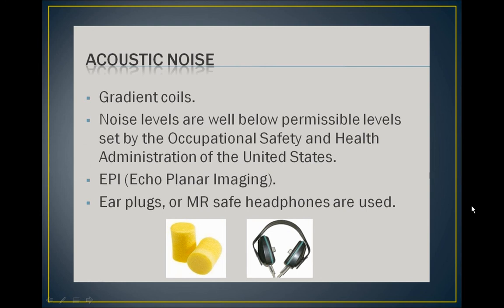These sequences still do not cause hearing problems, but for patient comfort, we must always supply ear protection. Drawbacks to headphones or earplugs are that they may make it difficult to communicate with the patient. Because of this, it is especially important that the MRI technologists visually monitor the patient and communicate with them as needed. It is also helpful to give the patient the alarm switch or call ball so that if a problem arises, all the patient must do is squeeze the call button and an alarm will sound near the technologist to ensure a rapid response.